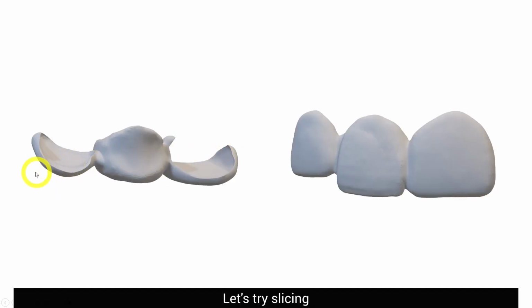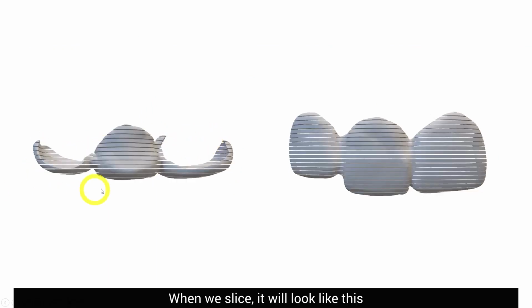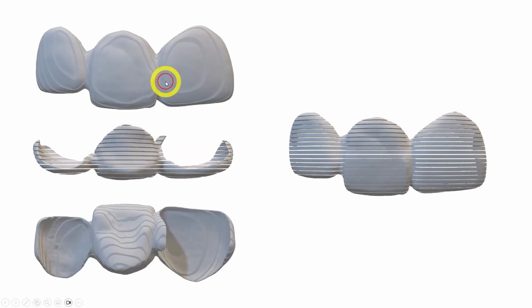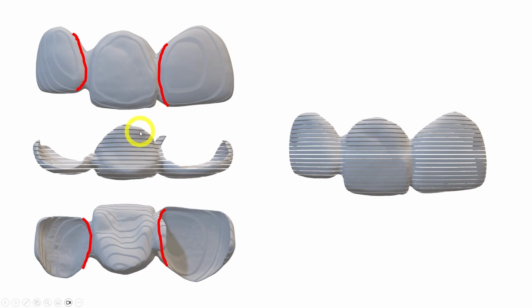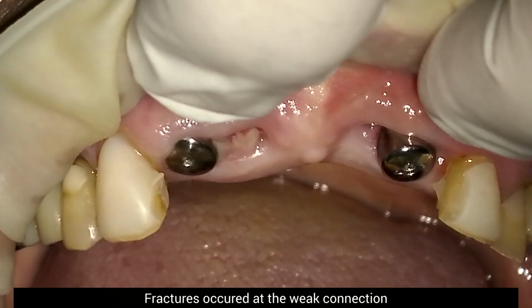Let's try slicing. When we slice, it will look like this. When you print it in a horizontal position like the left, a weak part of the connector can be easily fractured because it will create vertical lines. I will show you a fracture case. Fractures occur at the weak connection.